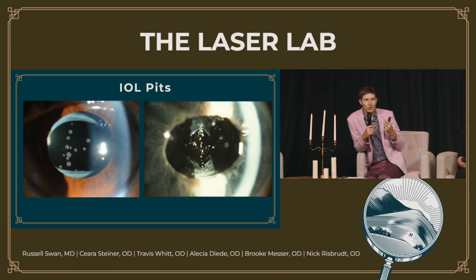Again, the goal with a low-powered laser with a posterior capsule offset is that you're hopefully avoiding that. I will say there are certain lenses that are far more common to IOL pitting, and if you're jumping into the YAG game, it's worth knowing that because these are lenses where you may offset your posterior offset further or lower your energy level. So the 2 biggest culprits are any silicone-based IOL. The most common silicone-based IOL that we currently use is the light adjustable lens, which has a silicone monomer. But there are also some silicone lenses that are commonly inserted as a 3-piece lens by some surgeons.